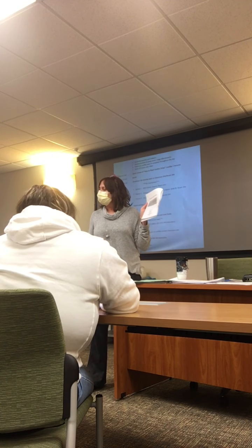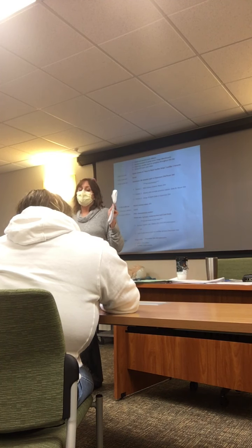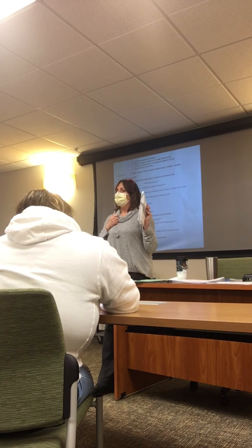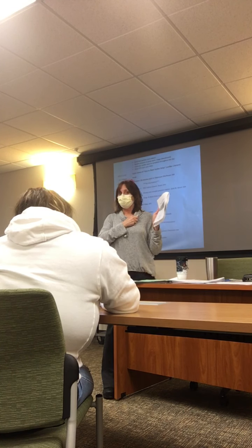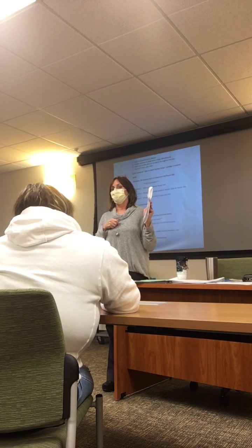I need to figure out where this extra beat or premature beat is coming from. So you'll see either premature ventricular contractions or premature atrial contractions. How do I tell the difference between whether the premature beat is coming from the ventricle or the atria? The QRS complex. Because the QRS measures, it's coming from where? Ventricles. So if my QRS complex was normal and it was premature, where is it coming from? The atria. So that would be a PAC.